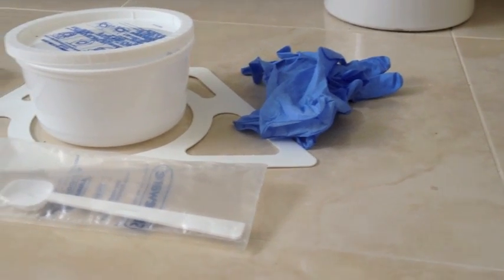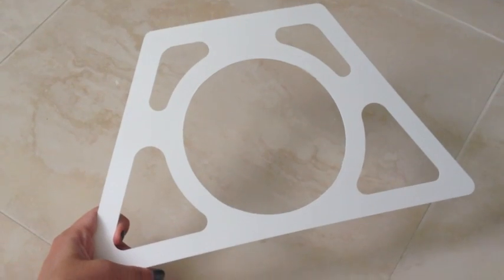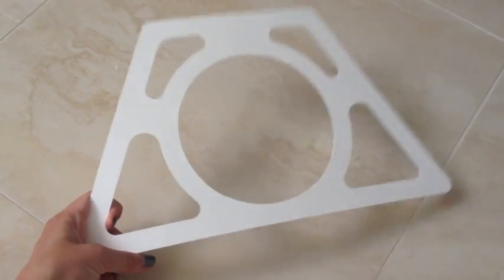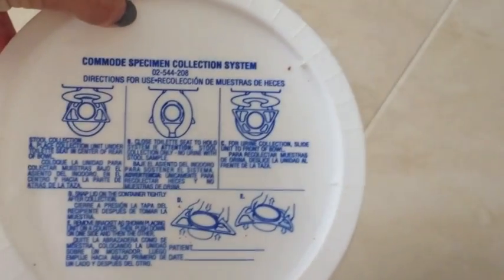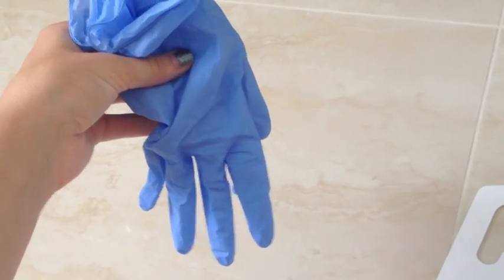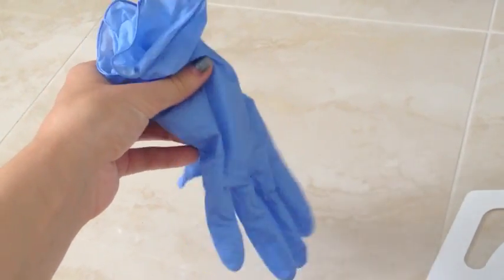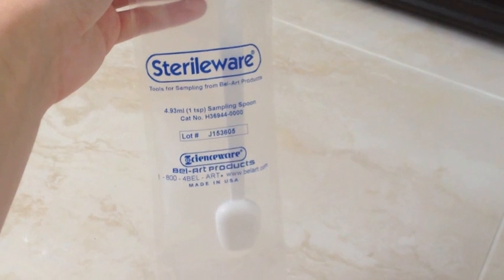Your doctor will give you the stool sample kit needed to collect the sample. In it, you'll find a plastic trapeze-shaped holder called a nun's cap, a bucket with a stool lid that also has some instructions on it, a pair of gloves, the sample tube, and a spoon.